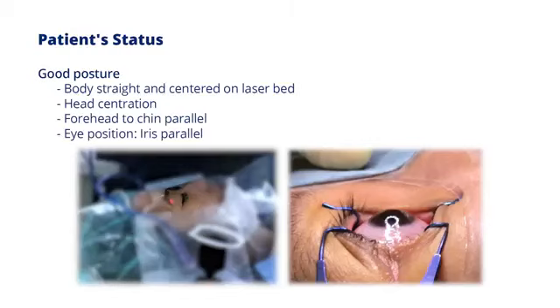For eye position, you should keep the iris plane parallel to the floor and open the eyelid wide enough with speculum. Adjust head and chin position to have equal sclera show.